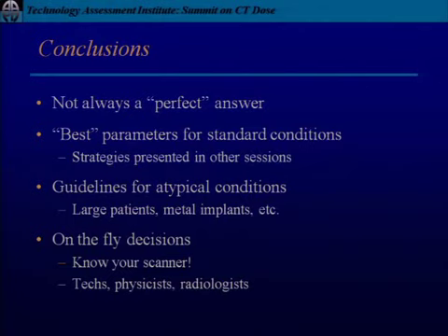And just one other comment is what's your opinion, because I really would like to see the AAPM or the ACR get to a point where we have some kind of overburden that's on top of the ACR Phantom so that we can actually use the dose reduction software. Right now we have to turn off all of that dose reduction software, and we can't really tell, is this an appropriate abdominal helical scan that we have, because we kind of fool it into doing this thing without any dose reduction software like CareDose 4D or Smart MA, Auto MA.